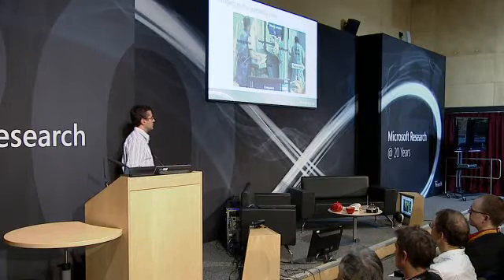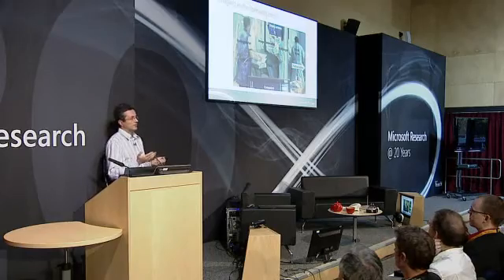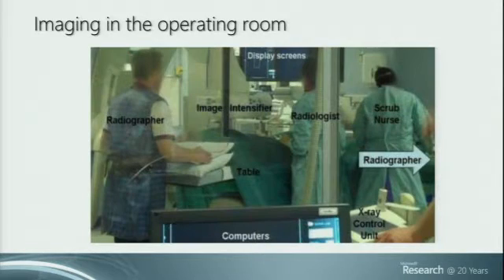Because I need to know where things are, whether they have moved, where is better for me to cut open, and so on. But remember that in an operating theater, everything or almost everything is sterilized to avoid contamination. So a surgeon has got gloves and perhaps he's holding a scalpel. At the same time, he wants to manipulate the patient images, move them around, go to the previous one, or zoom in, zoom out. So the way it works right now, because he cannot touch a mouse or a keyboard, is he gives instructions to a nurse or someone else.